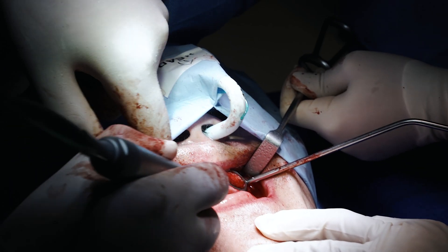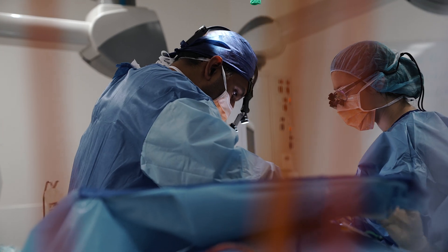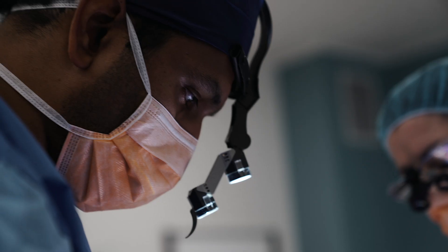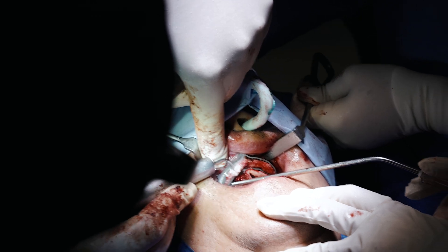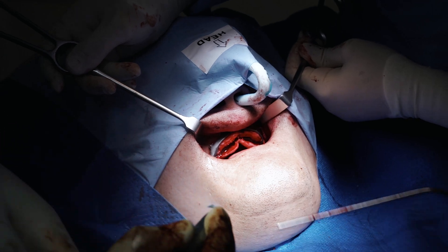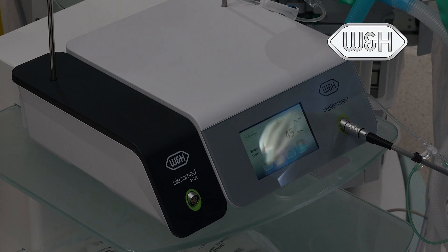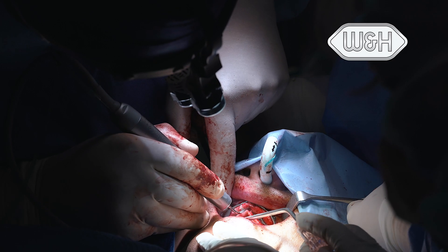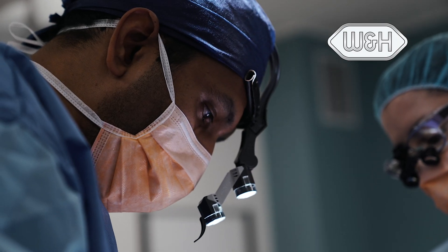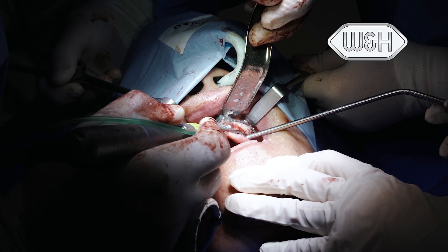In this situation, we used a custom cutting guide to perform an alveolectomy. The purpose of this was to ensure a nice smooth flat base for the prosthesis, and also in the long run to ensure ease of cleansability for the patient. We secure the cutting guide, which is made out of titanium, to the alveolus using two titanium screws. We then use the W&H Piezo Med to perform the alveolectomy, although this can also be done using a round burr and a surgical handpiece such as the S11 handpiece.